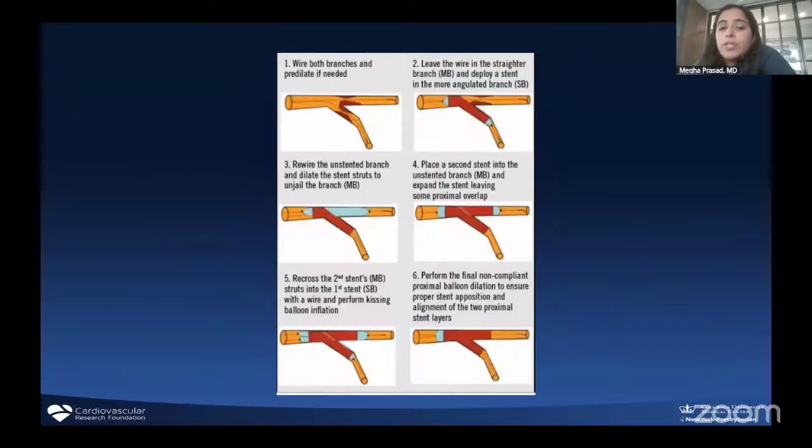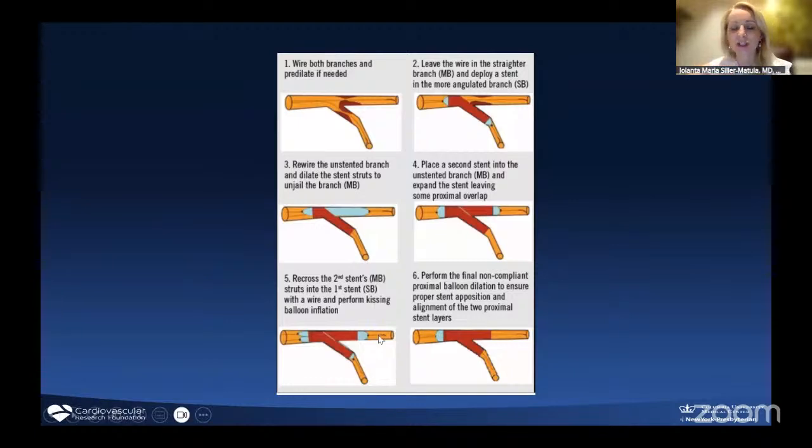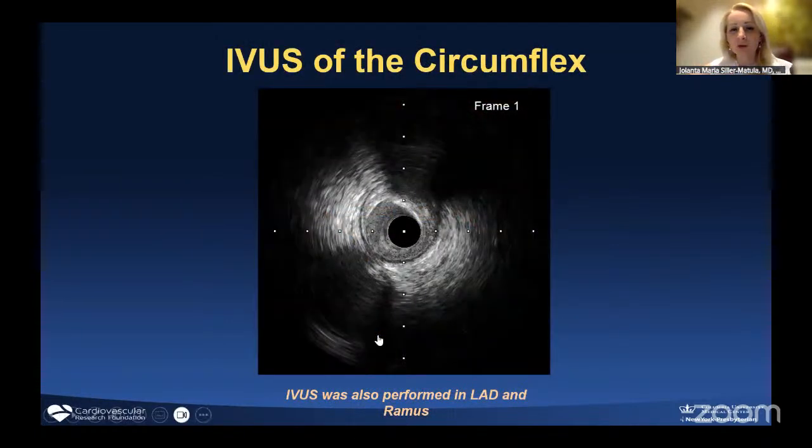So we proceeded. Yes. Just to ask, so for lesion preparation, which sizing of the balloon have you been using? Just like 1:1 arterial ratio based on your IVUS, or 1 step down, or cutting balloons?